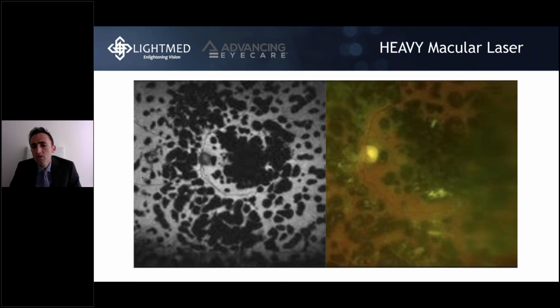I've had multiple cases where I repeated the treatment. Let's say you have a patient with glaucoma or susceptible optic nerve, you did the first treatment, you got some improvement, let's say from counting fingers to 20/400. And the patient tolerated the treatment well, so let's say you gave it 4 to 8 weeks, but there's still some edema or swelling, so you can certainly repeat the treatment with the SP mode within 6 to 8 weeks after the first session, especially if this is a patient you think had a reasonable initial response, or they have susceptible optic nerves, or they actually prefer the laser treatment over the intravitreal injections. Some patients are bothered by the burden of the injections every month, and they want to entertain other treatment modalities that can last them longer or maybe decrease the burden of the injections. So you can certainly utilize the laser as an adjunctive treatment in these cases as well.